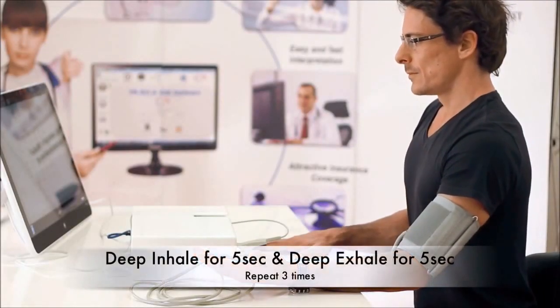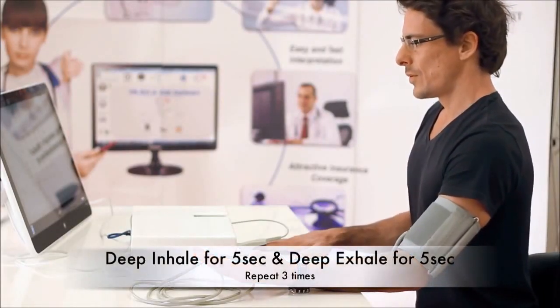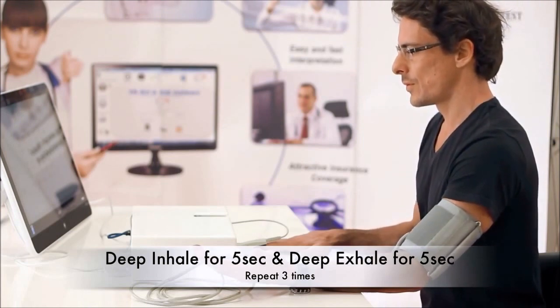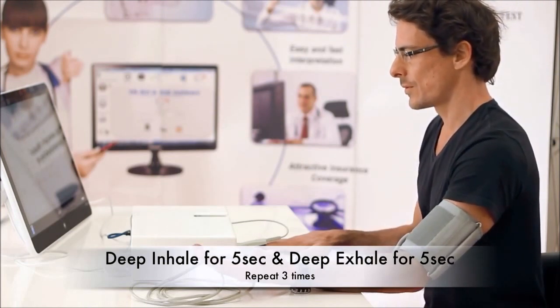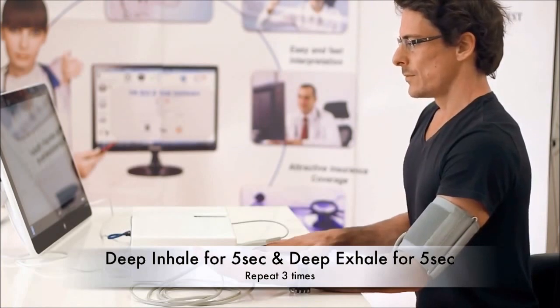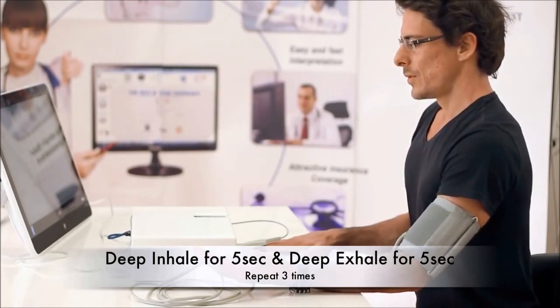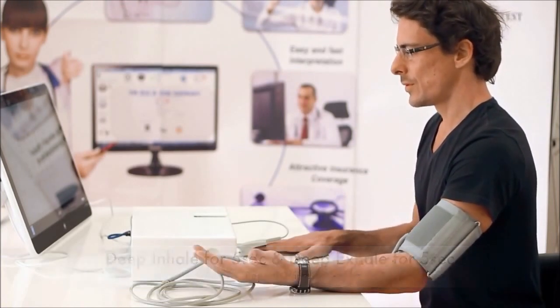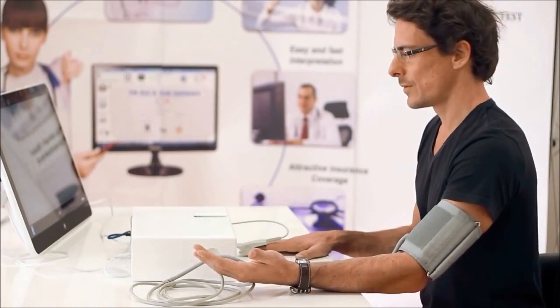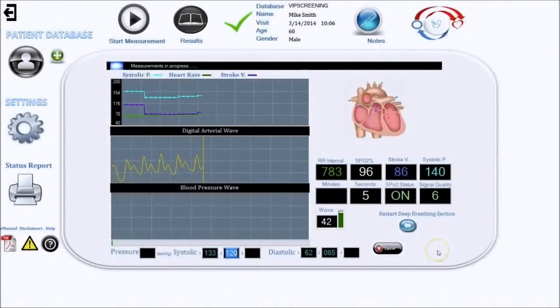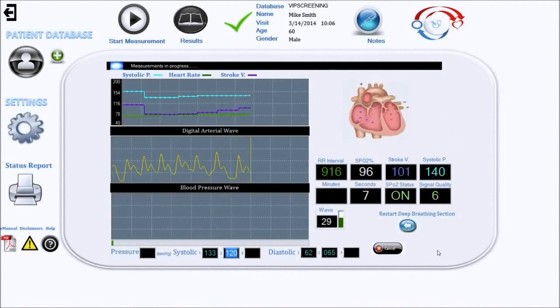It is time to explain to the patient how to perform the deep breathing procedure. Once the patient is ready, click start and using the software timer, have the patient adjust his breathing. Slowly inhale for 5 seconds, and exhale for 5 seconds. Repeat 3 times. Software is recording the change in heart rate during this procedure.